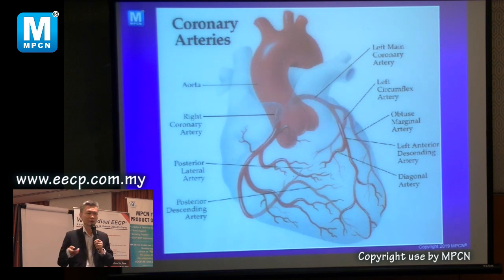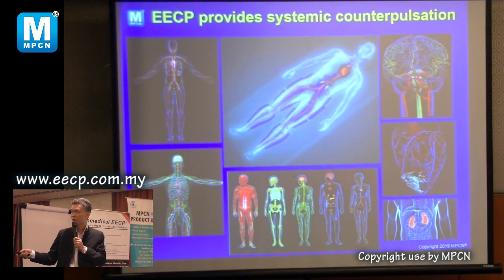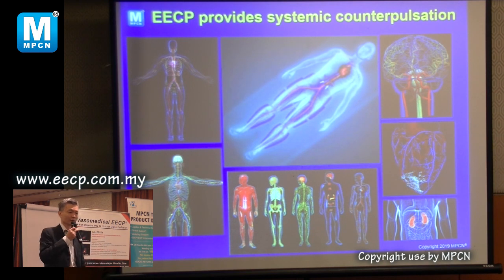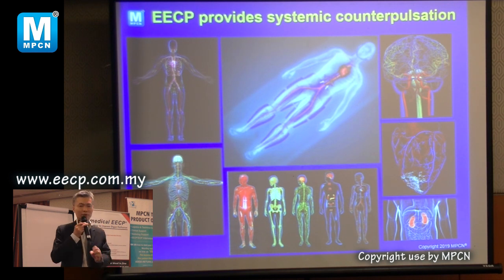So when is the time when EECP helps this group of people, the patients with a blockage who cannot go for operation, you can consider this therapy. So EECP works by the pump contracting when it's relaxed. So when it's contracting during relaxation, it's a reverse flow from the leg to the rest of the body. So it can increase perfusion or blood flow to most of the organs in your body. So it's a very forceful contraction.